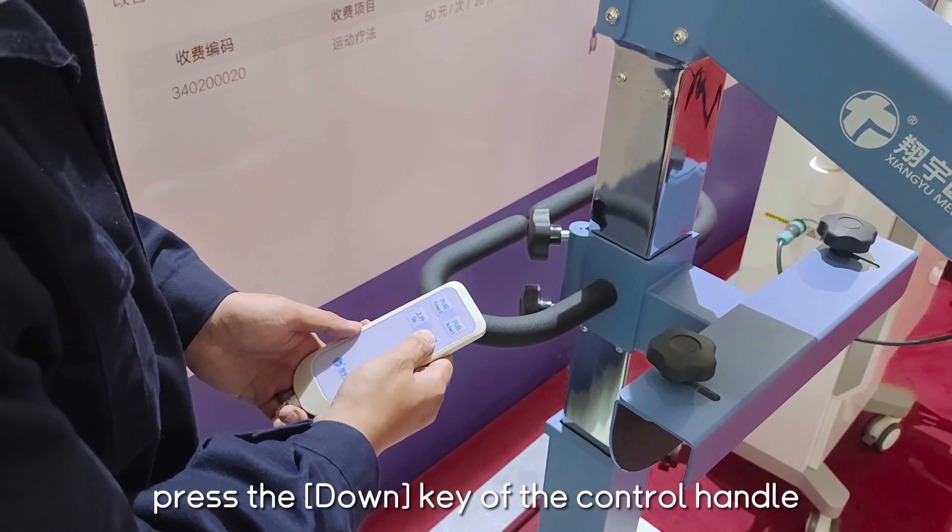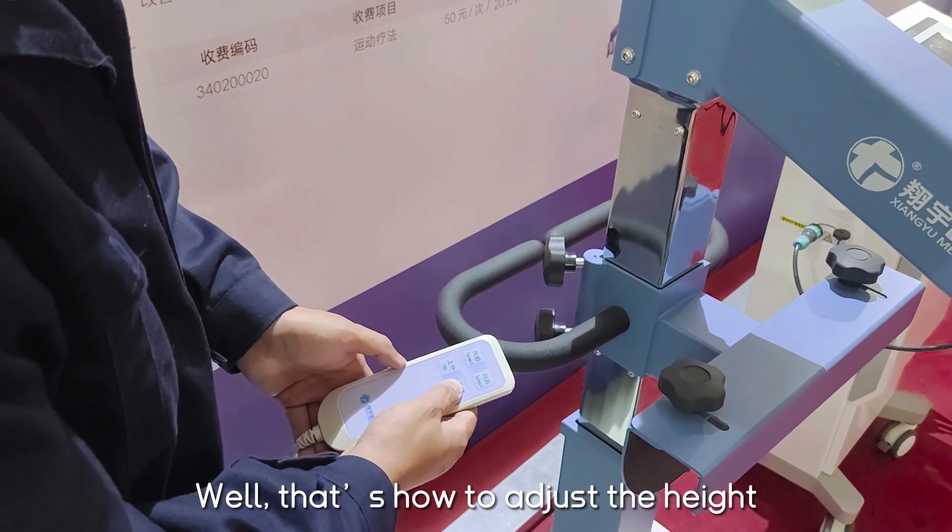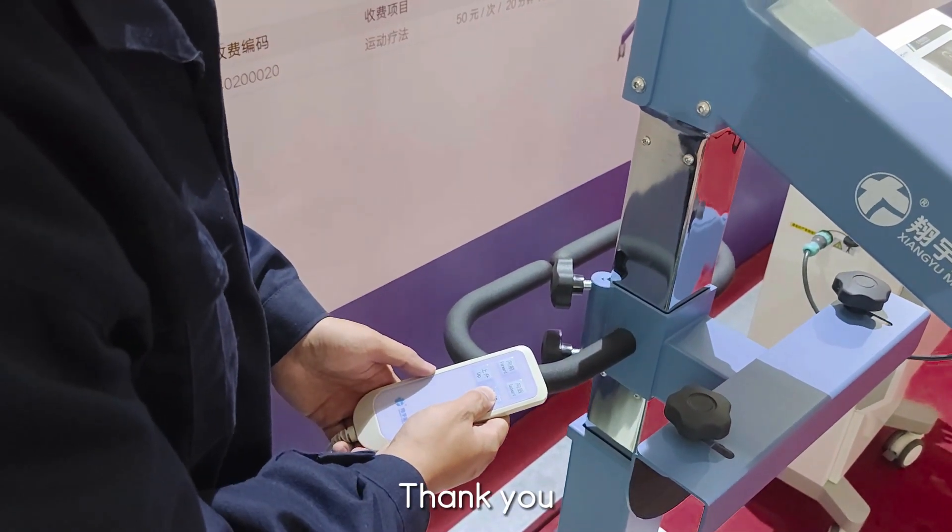Press the DOWN key of the control handle to change the height of the training device. That's how to adjust the height. Thank you.